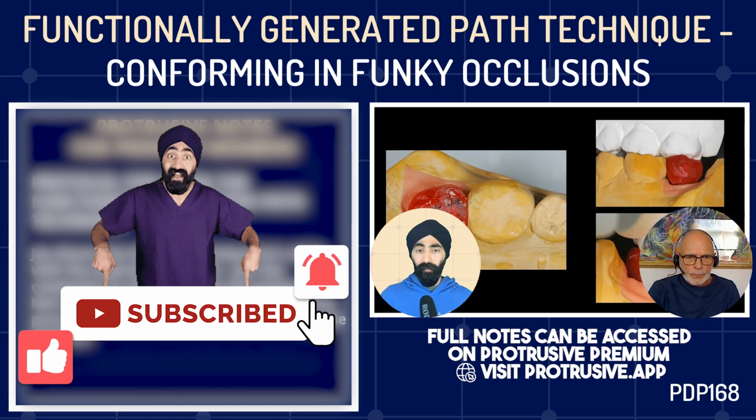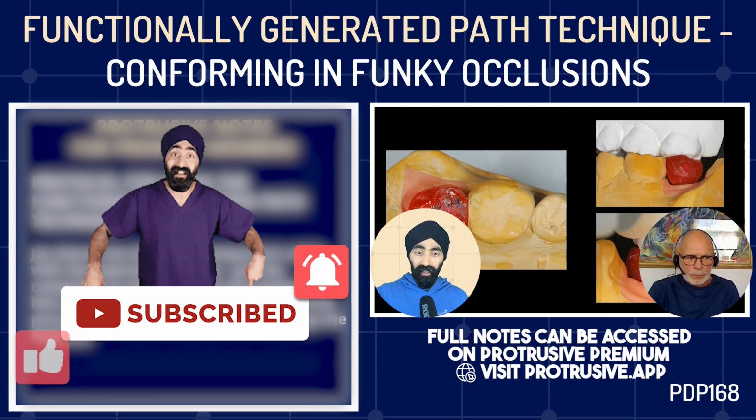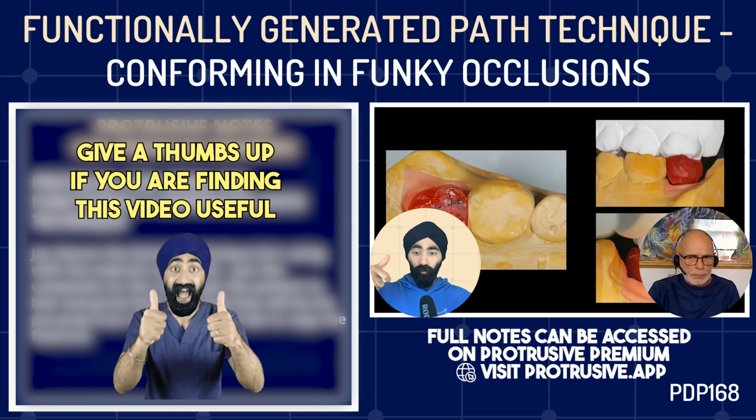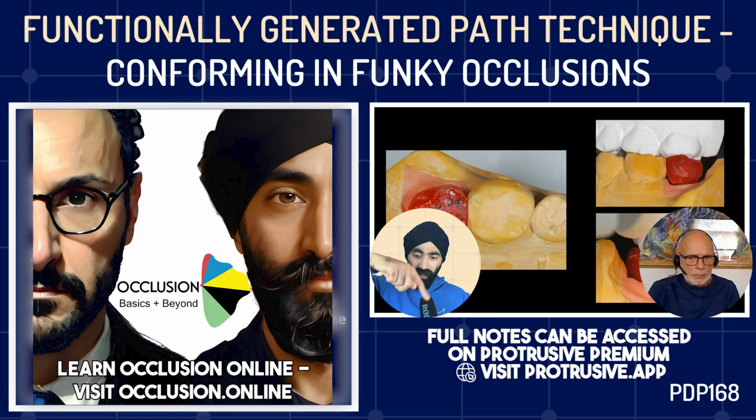I will get some expired composite out. I'll dry the tooth in question, let's say a lower left molar with broken cusps. I will squirt some of this expired composite on, manipulate it with my fingers around the tooth itself, get the patient to chew, grind, and then just cure it. And then I'll make that my pre-prep scan.